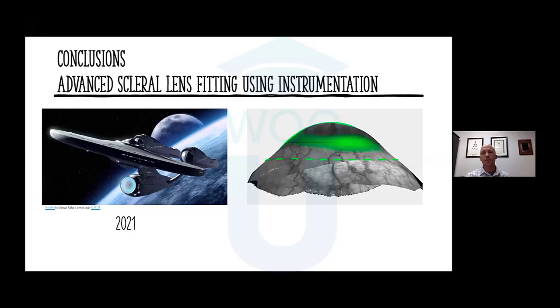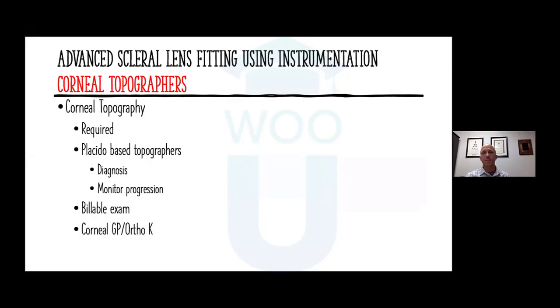So it's really a fun time to be a scleral lens fitter. I just really want to spend the last few minutes circling back around to these instruments and going over some of the highlights. So corneal topographers: almost required in practice for diagnosis of patients for fitting corneal gas permeable contact lenses. They're great because it is a billable exam.